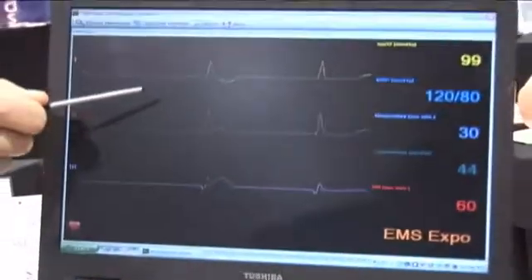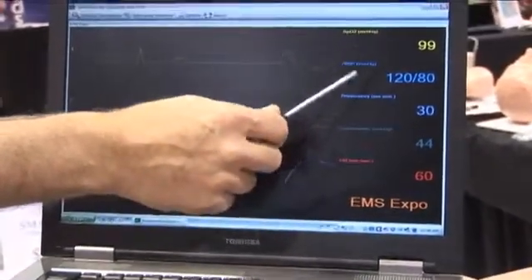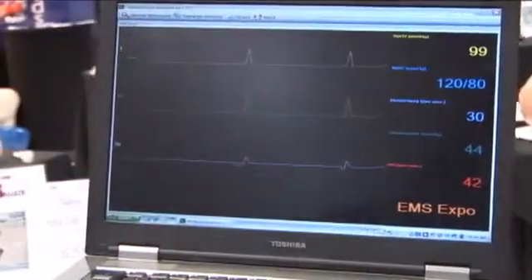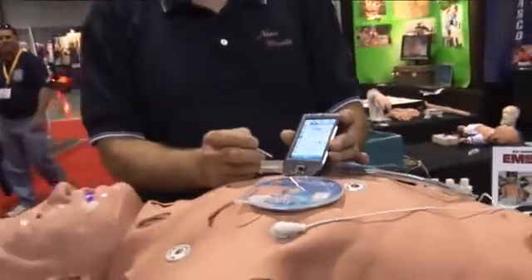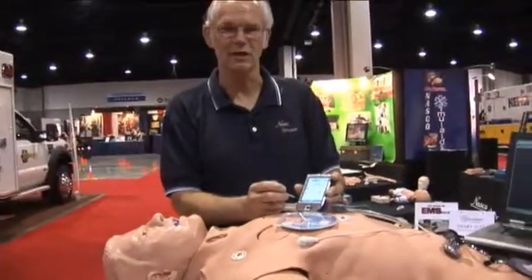That also shows up on our five-line monitor device that also shows you the heart rate, SpO2 level, blood pressure, etc. So this entire package you can buy for $27,300 and it gets all the options.